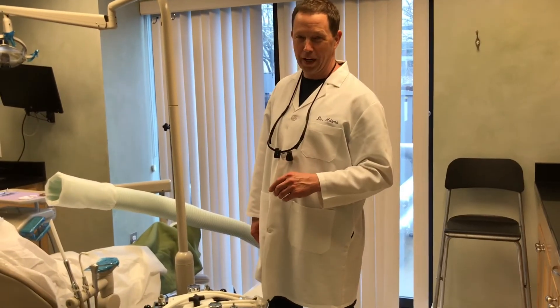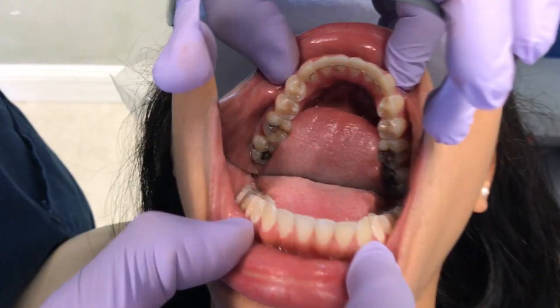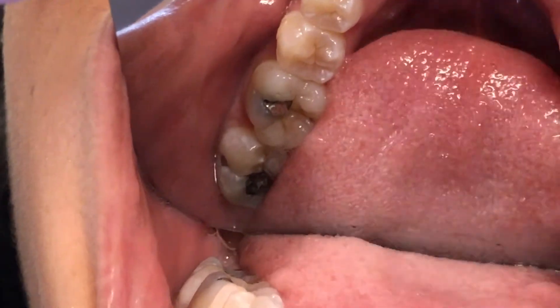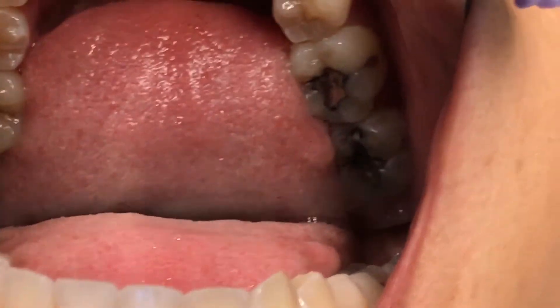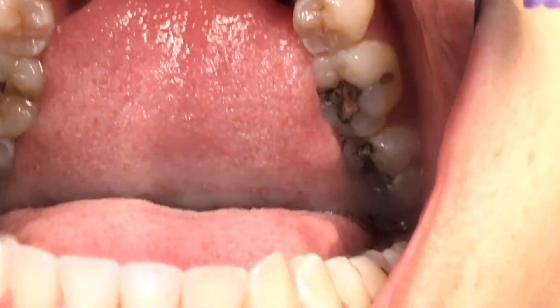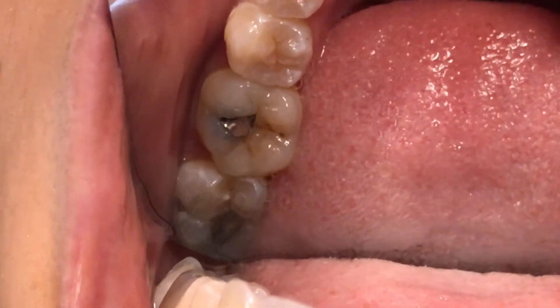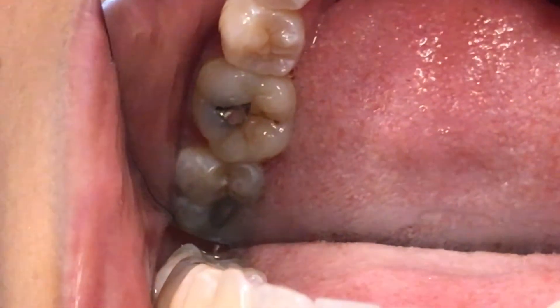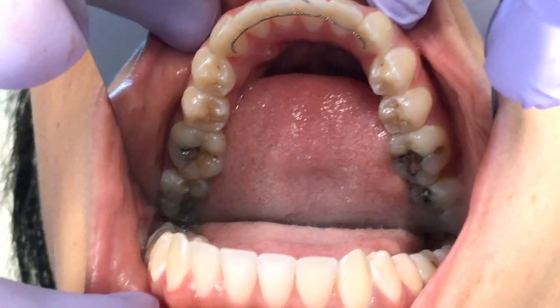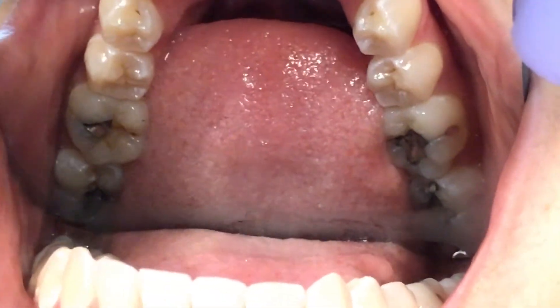We're going to go ahead and put the dental dam on and show you how that works. We are looking at a few amalgam fillings that we're getting ready to remove — there are two on the lower left and two on the lower right. You can see there's a little bit of gray haloing around the filling, where the fillings have been leaking and there's a little bit of decay. For the most part these fillings are pretty well placed — they are probably 20-plus years old and they're certainly beginning to fall apart, which is why we're removing them.